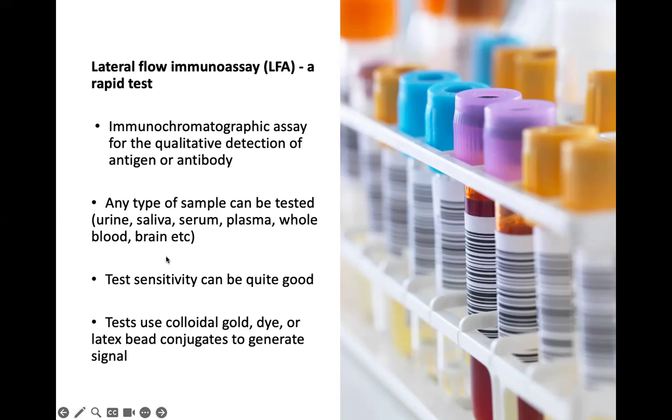The sensitivity of the lateral flow depends on how good you design it, how good your biomarker is, and also how good your nanoparticle is. Most of the time we use gold nanoparticle.